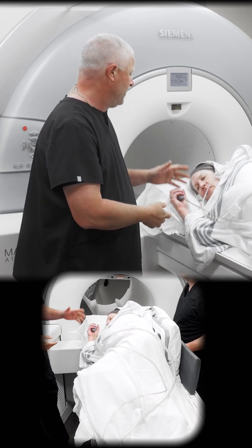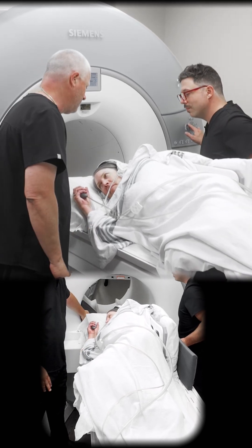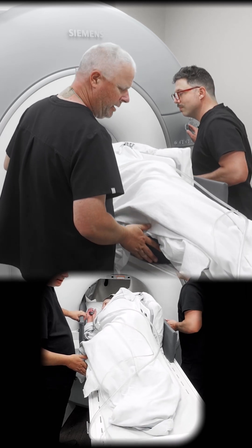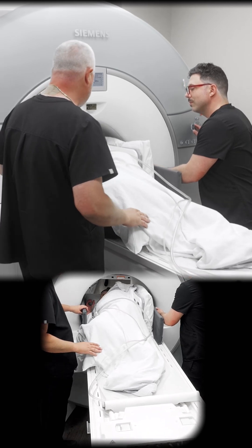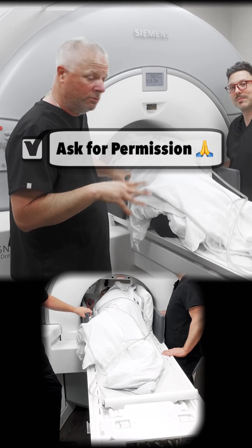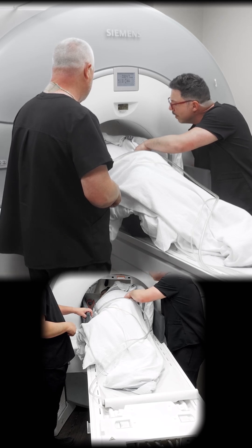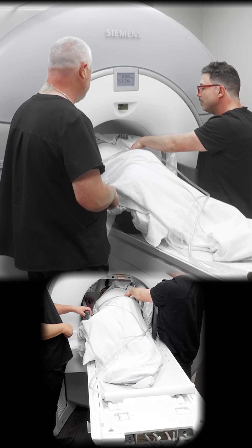You're doing okay? You comfortable? Alright, we're gonna go ahead and get started. We want to make sure that their knees aren't going to hit the bore. I'm gonna make sure all the cables are out of the way, and before we start poking and prodding, we want to let the patient know that we're going to do that to get our landmark, which is about two or three fingers above the crest. I'm going to feel for the top of your hip right there — perfect.